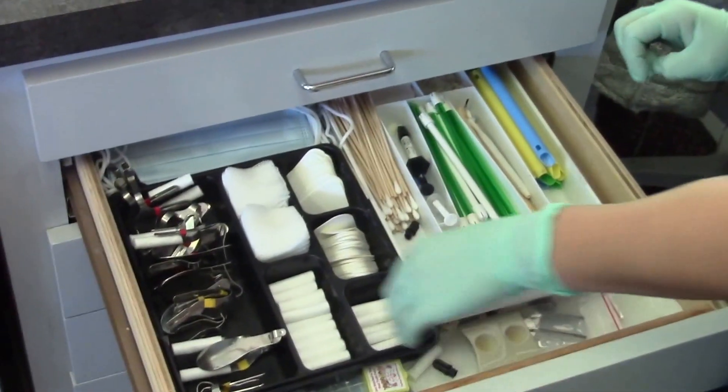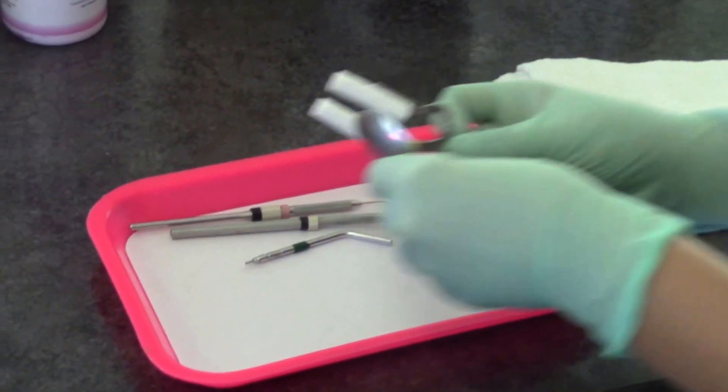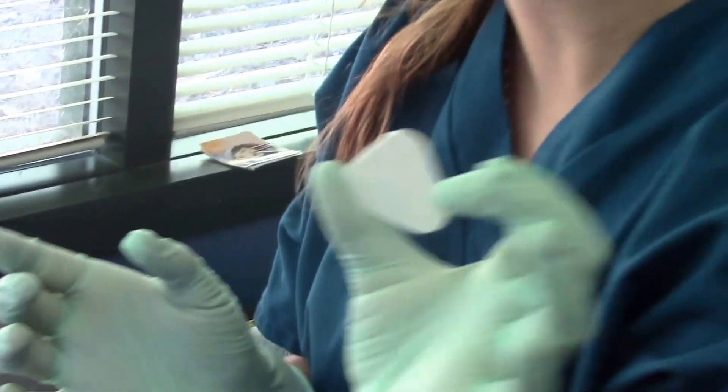We'll start off with putting our cotton holders with the cotton on them — this is the left side. And our dry angles; it's kind of easy to remember: triangle, triangle.